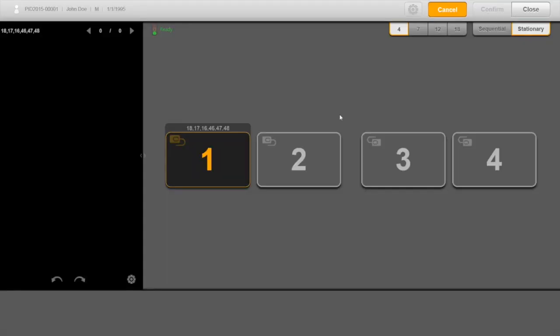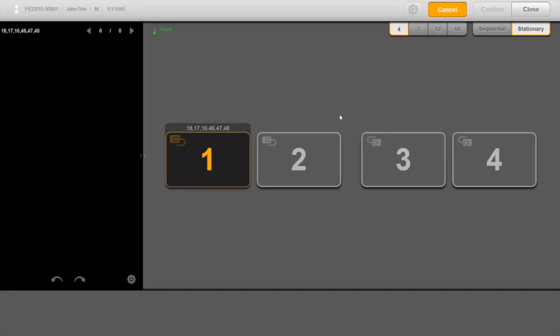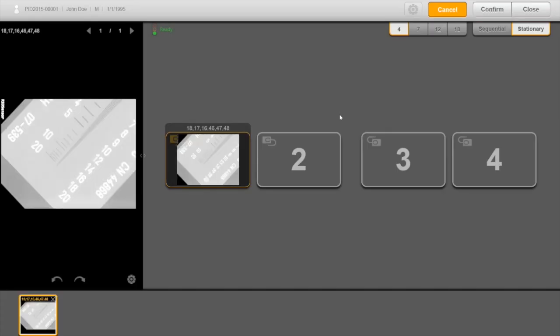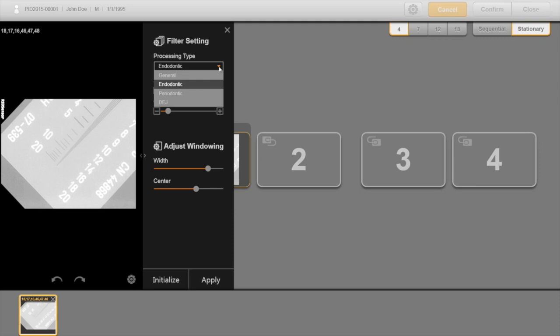Image Enhancement. RioView's image manipulation and enhancement tools enable users to improve image quality without having to reshoot x-rays or other images. This is your real-time filter. This tool offers a real-time adjustment that can be utilized for diagnostics without having to modify the original image. Depending on the user's specialty, the filter provides GP, endodontics, and periodontics option.